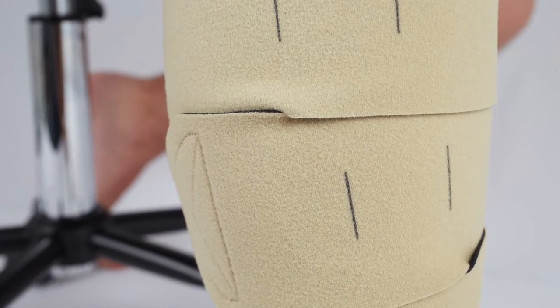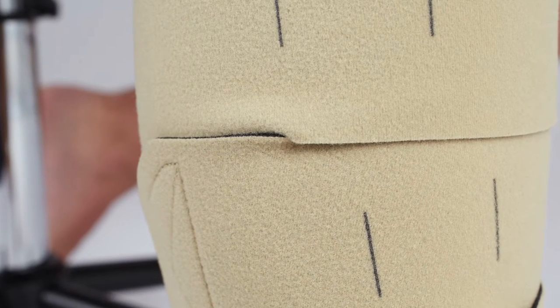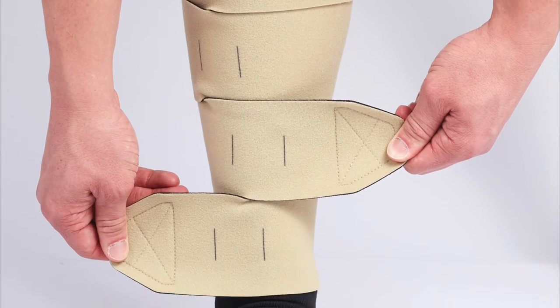Adjust each band to a firm and comfortable compression. Once all the bands are secured, inspect the garment for any gaps or creases. Adjust the bands as necessary.